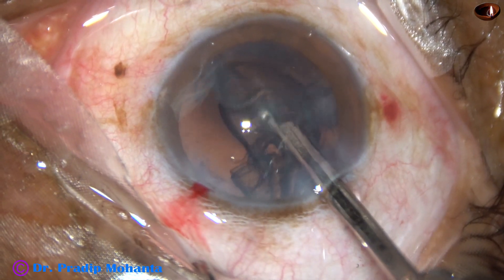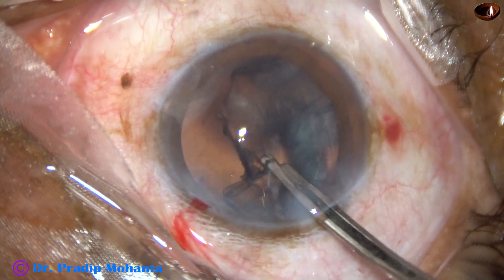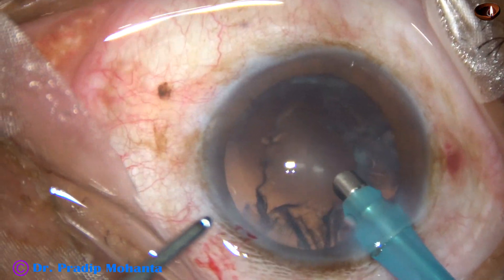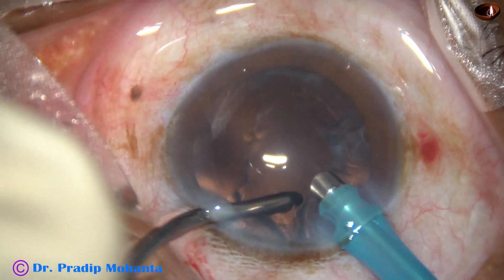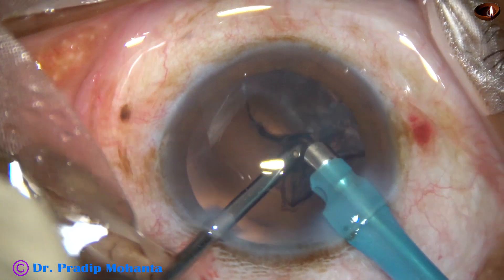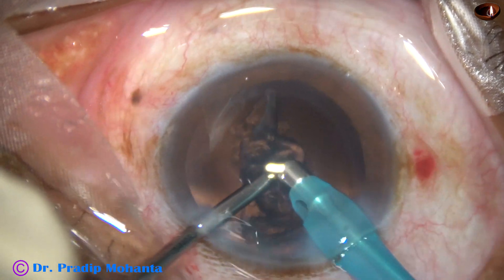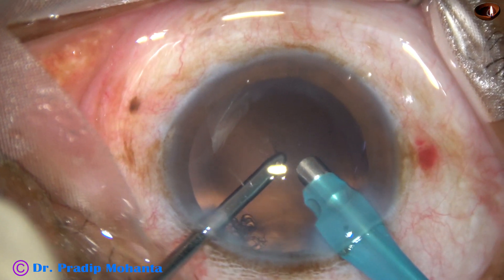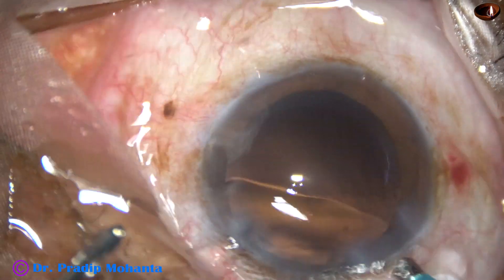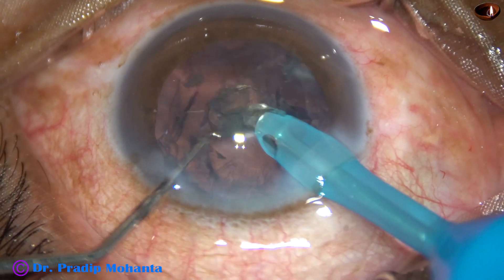First, I aspirate the sub-side port cortex by a 23-gauge Simcoe cannula. Then come out and introduce the irrigation and aspirate through the side port. The advantage of this technique is you just need one small side port — you don't need two side ports. Irrigation can be through the main incision; you just have to block the main incision and do the job.